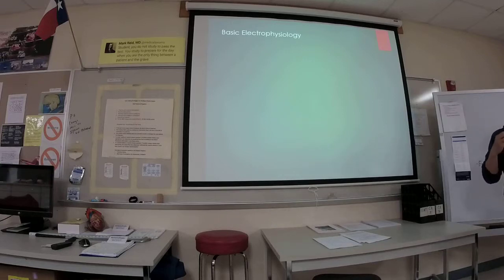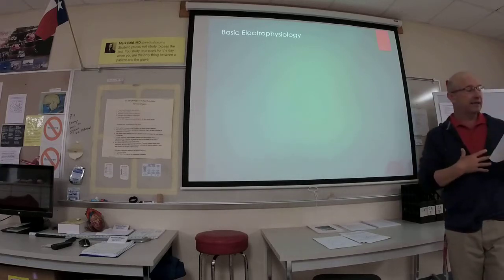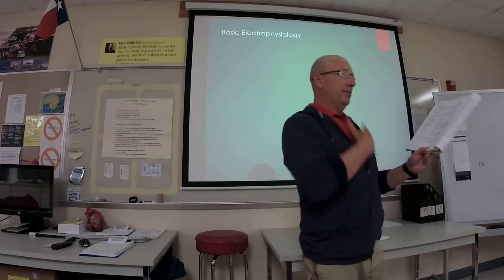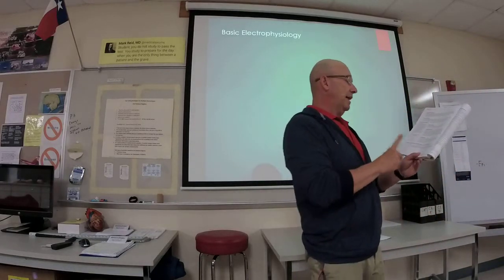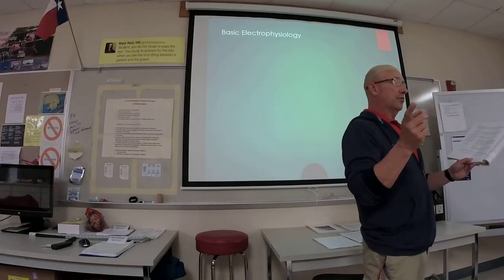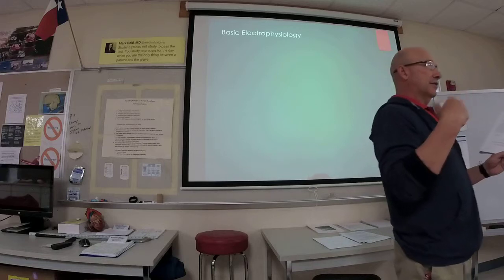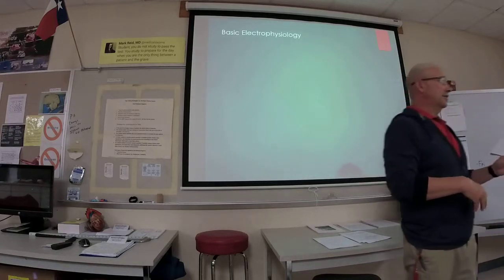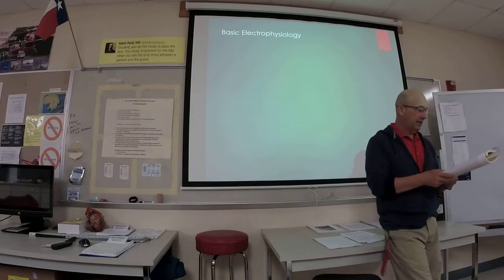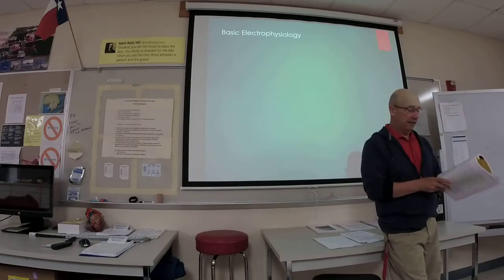Unipolar leads, precordial leads, the V leads is what I call them, the leads that measure the front part. Augmented leads, and then the bipolar leads is like your normal EKG leads, like the 4 lead or 3 lead EKG leads. Okay, so be familiar with that, the terminology behind it.